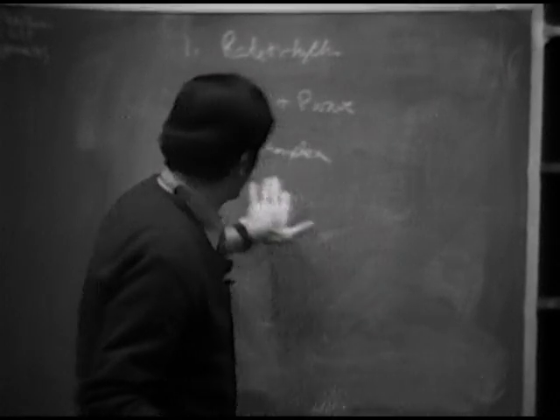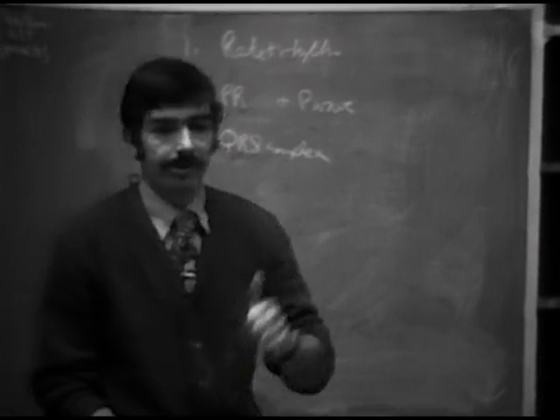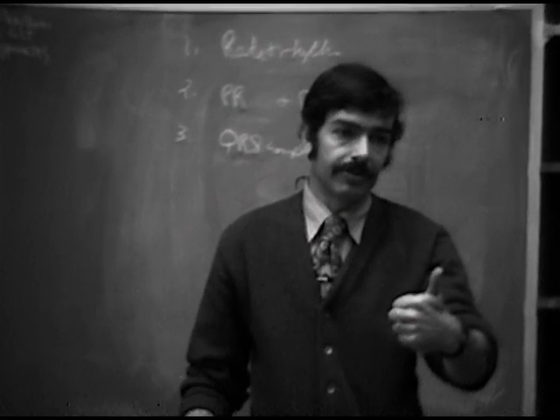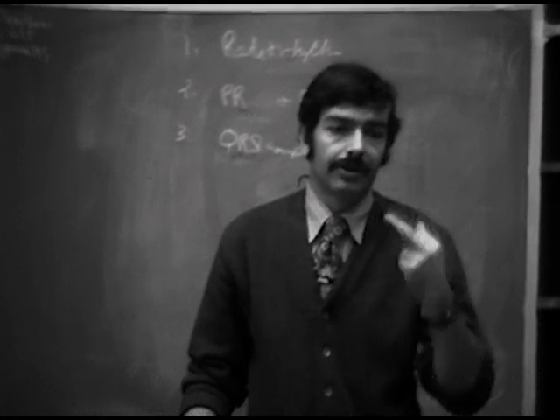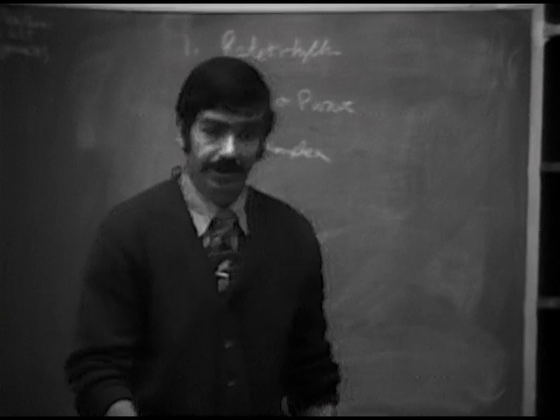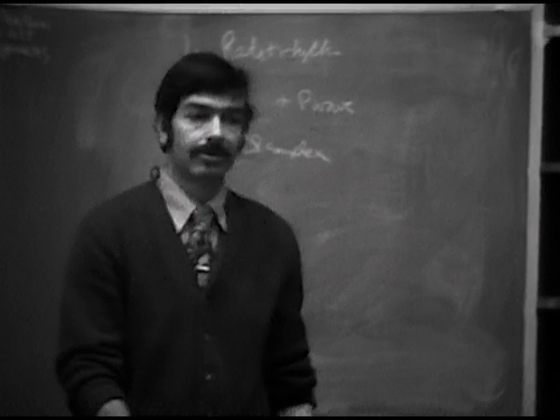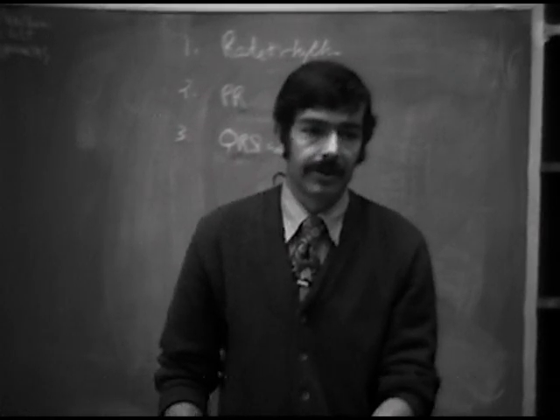Then you look at your electrocardiogram and ask yourself, which part of that QRS is prolonged? Is it the beginning? Is it the whole thing? Or is it the end? If it's the beginning, you're dealing with a WPW, most likely. If it's the whole thing, you're dealing with intraventricular block. If the terminal portion of the QRS is prolonged, you're probably dealing with a bundle branch block, though you may be dealing with a peri-infarction block. That's less common. By far the most common form of terminal conduction disturbance, though, is a bundle branch block.